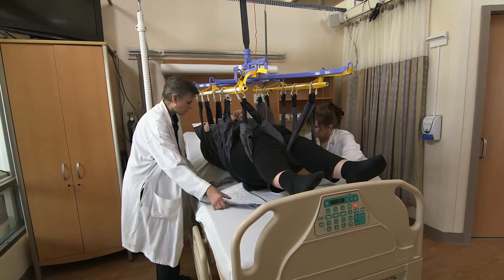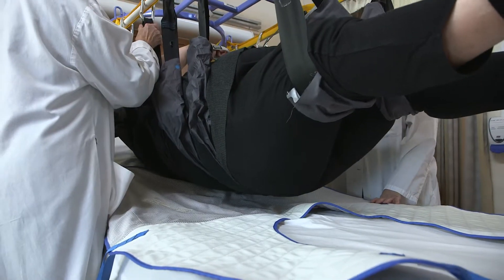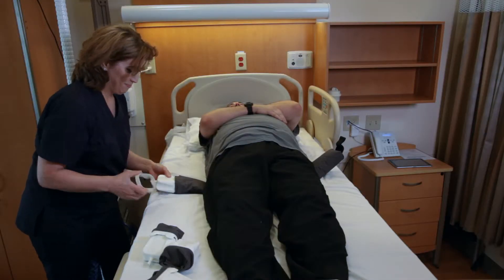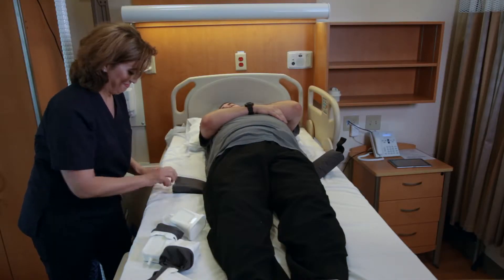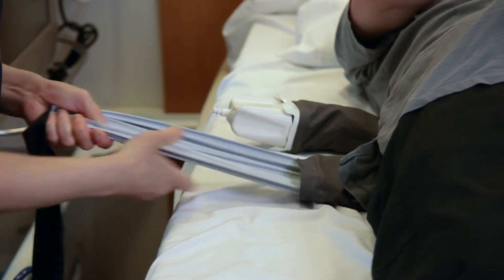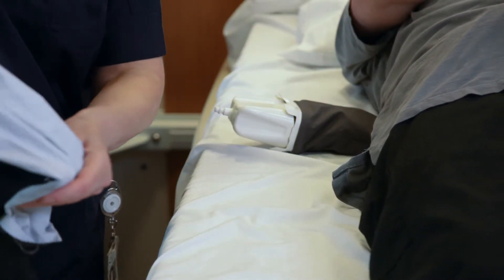Having the patient elevated also gives health care workers the opportunity to insert a bedpan, change sheets, or reposition the patient as needed. Sling Surter is just as easy to remove — just pull the exposed end out. It's designed with the patient in mind. As you pull, Sling Surter turns inside out so there isn't any friction or discomfort from the straps for the patient.